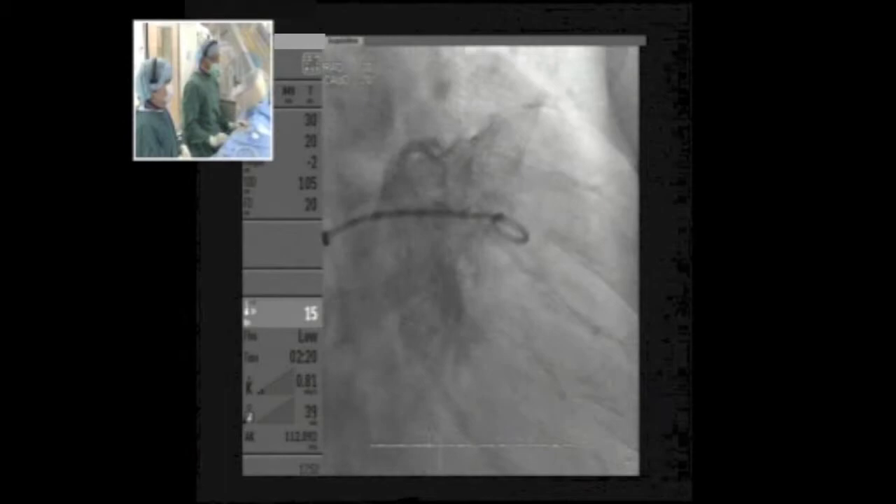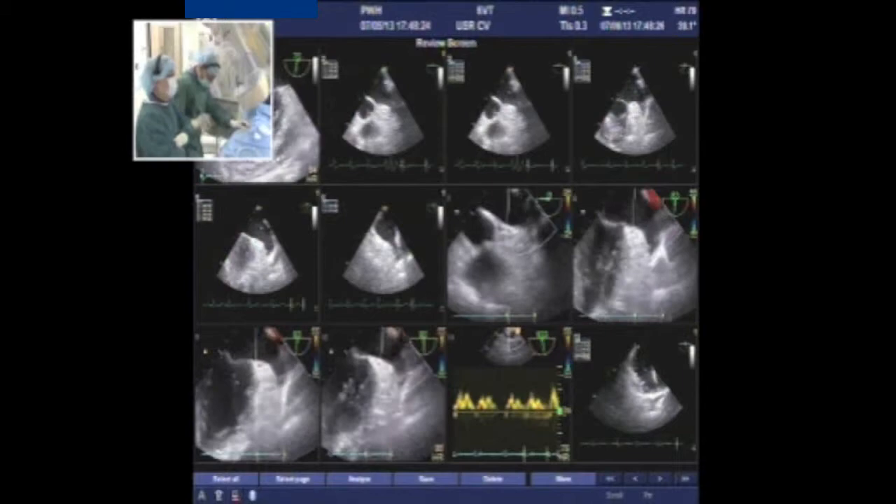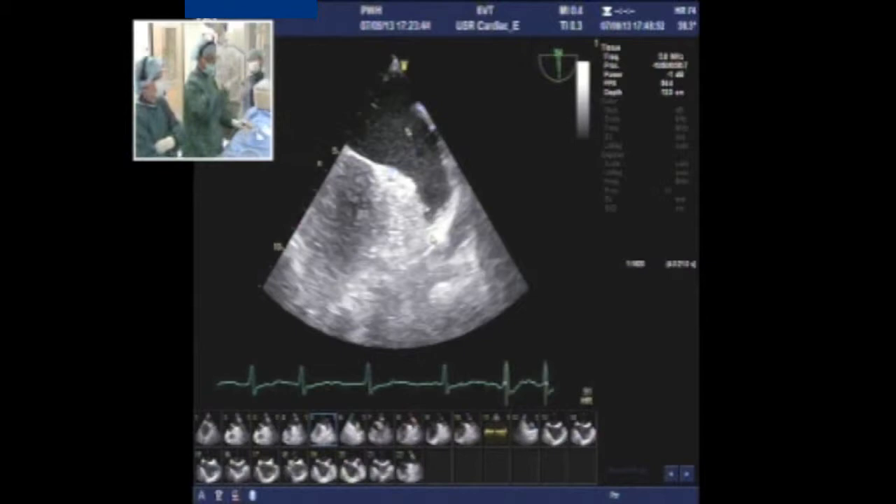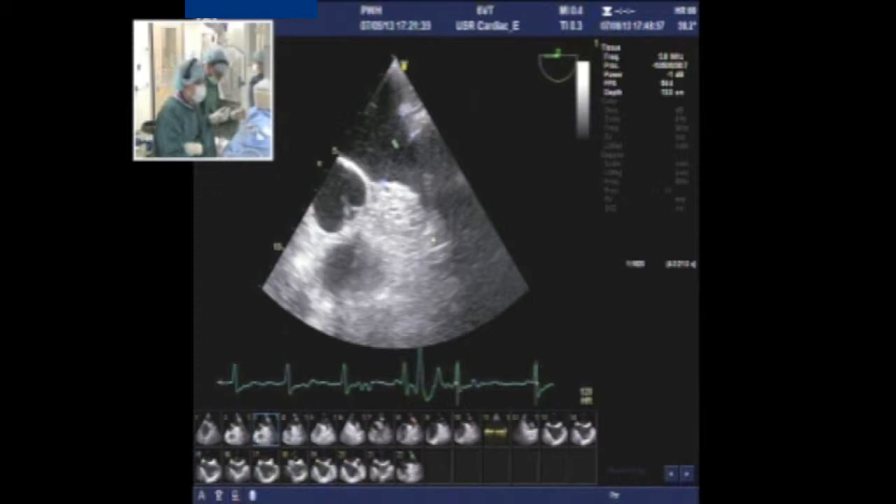We should now do some measurements and correlate what we find on echo with the angiogram. I'd like to remove the pigtail from the appendage while we do that to avoid any trauma. Alternatively, one can put a stiff wire in the left upper pulmonary vein — that's a safer option than parking a stiff wire in the appendage. I suggest removing the pigtail and leaving the SL1 sheath in the left atrium.